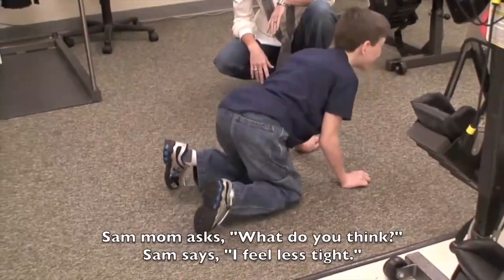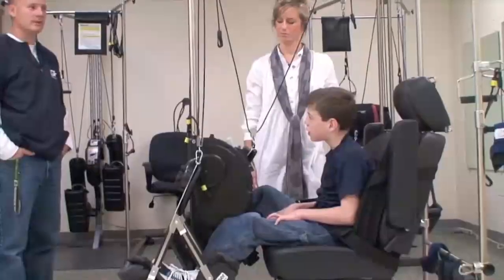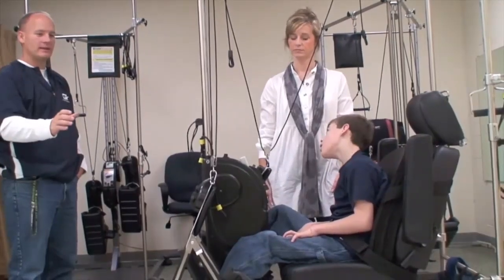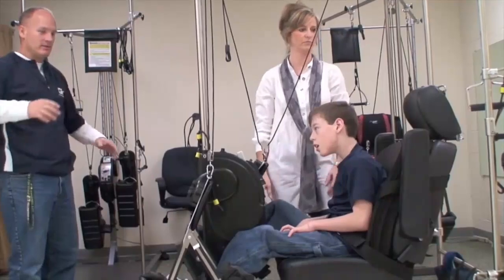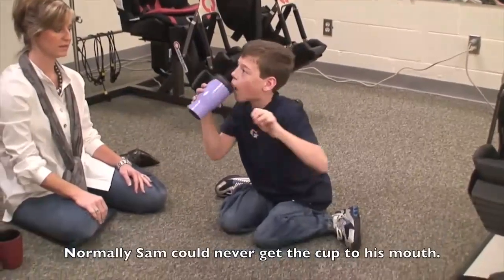The patient reports: I feel less tight — less spastic. The caregiver explains that normally if he's sitting at a chair at a desk trying to grab a juice box or can of cola, he has no stability, so he can't. You can see a little bit of shaking now, but normally he can never get it to his mouth.